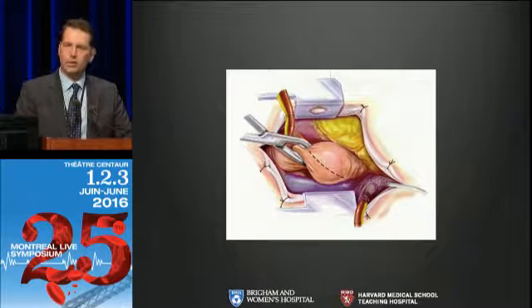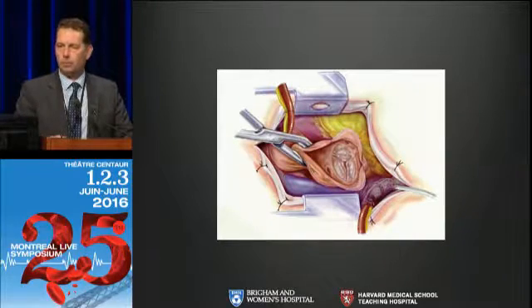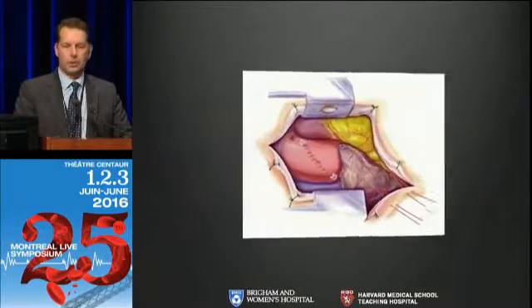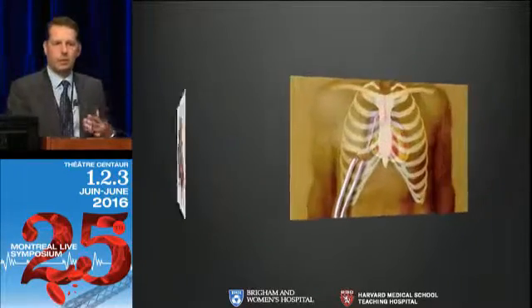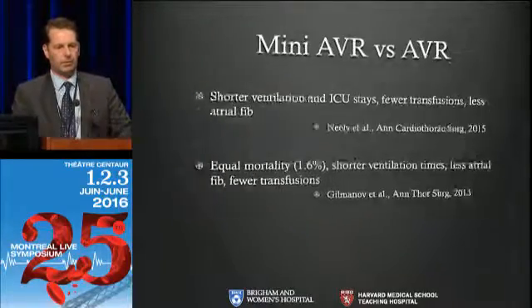So the cannulation can still be central through the aorta and the right atrium. You can still cross-clamp the aorta in the same way with the same type of clamp and open up the aorta. At that point, you can have usually pretty good visualization of the aortic valve, debride the aortic valve, and then place sutures as you normally would. And with this approach, the cross-clamp times and bypass times might be a bit higher, but you have a very standard approach. And that's important for people that are learning new approaches, especially with aortic valve surgery.